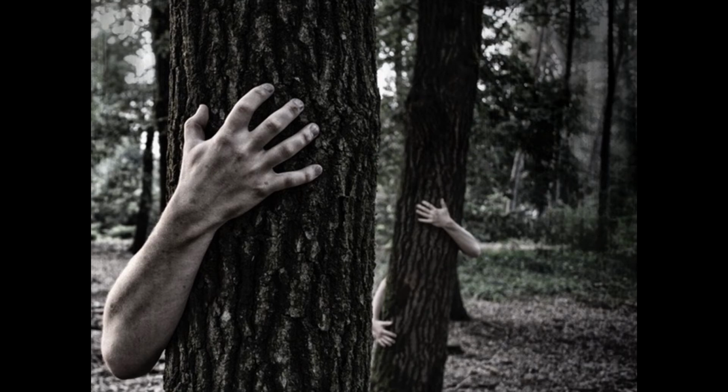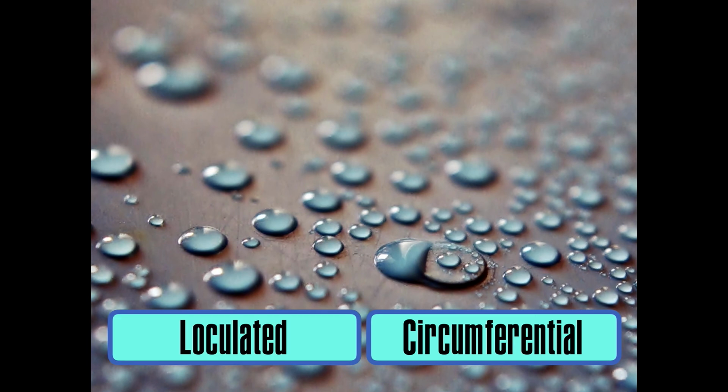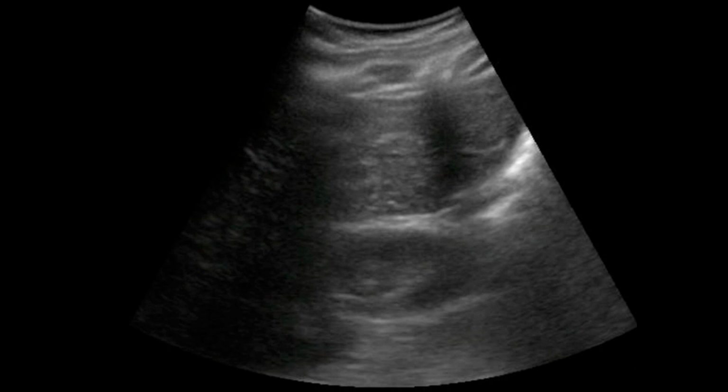Thickness, stones. Next really important feature, 3 of the 5, is going to be fluid. So fluid can be circumferential, but interestingly enough, it can also be very loculated, so focal. Cholecystitis does not follow a script. A gallbladder will not be uniformly surrounded by fluid in a nice, pretty pattern. It's often ratty and ugly and infected, right? So fluid, as you'll see in a moment, can be kind of stuck on one side of the gallbladder. So just keep your eyes tuned to that when you're doing these scans.